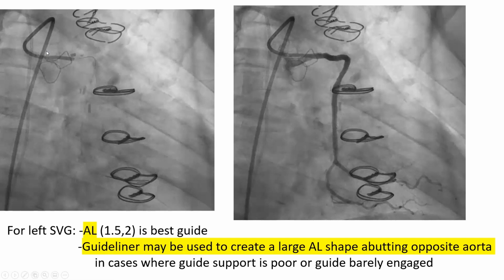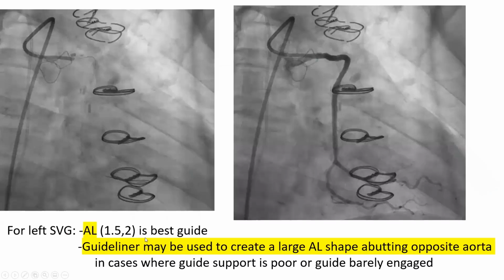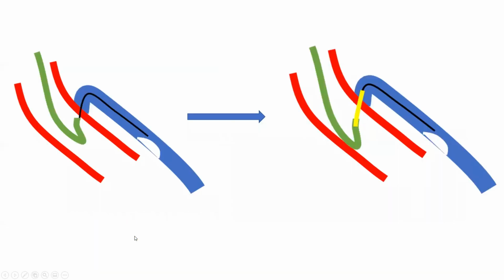But even with that, you may have difficult time getting support in left graft. So it is not uncommon to need a guideliner in left graft intervention. This is the reason: if your Amplatz left is not able to create that big shape abutting the aorta, you can use a guideliner to create an even bigger curve on that Amplatz and get the support from the opposite wall of the aorta. And in cases where you have a hard time engaging with an Amplatz left, you may do that technique with an IM or an LCB guide and convert it into a big AL guide.